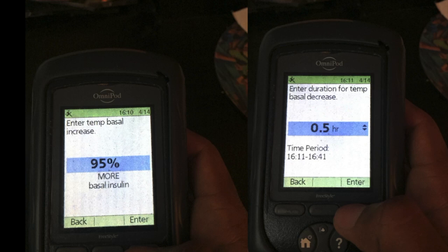You can increase as high as 95% more insulin, then you just select your time. That goes for either increasing or decreasing.